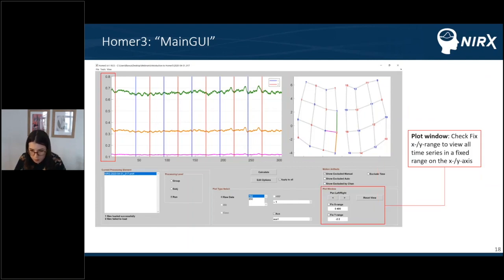We have also the plot window. We can use the plot window panel to zoom in and pan the magnified data by dragging the mouse over the data in the data window you want to magnify. To pan the zoomed data, click on the left or right arrow buttons in the panel. You can zoom out by right-clicking the data window. To reset the data displayed to the original time course, just click on the reset view button in the panel.